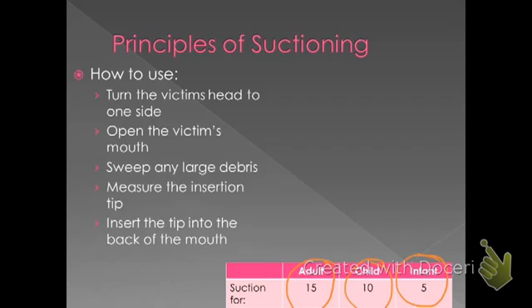One of the major reasons that you don't want to suction for longer than the times listed below is the fact that when we are suctioning, what we are also doing at the same time is removing air and oxygen during the suctioning process. And so that can cause a quick drop in the blood oxygen levels and also change the heart rate, right? When we have less oxygen within the body, the heart tends to work harder to circulate more oxygen throughout the body.